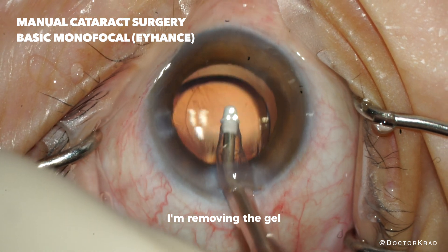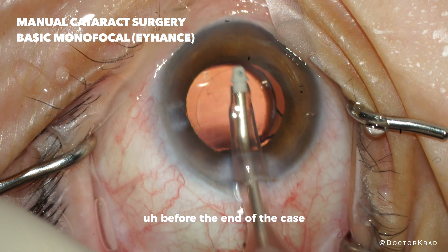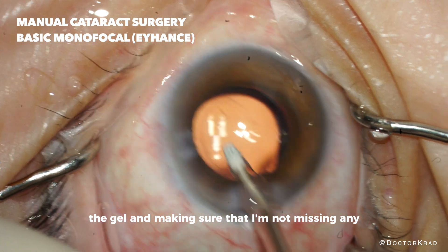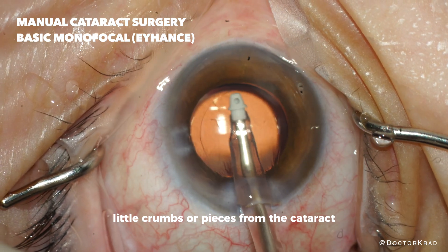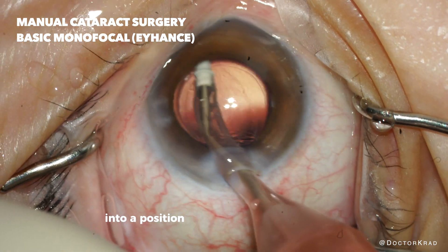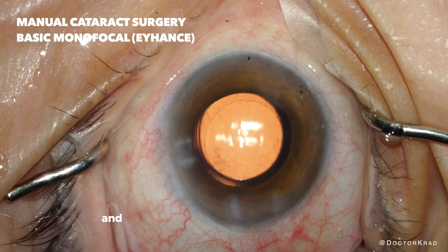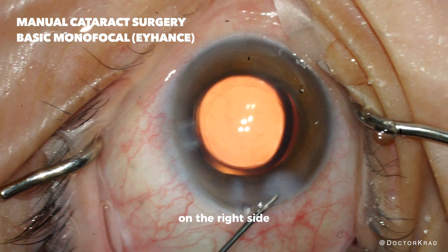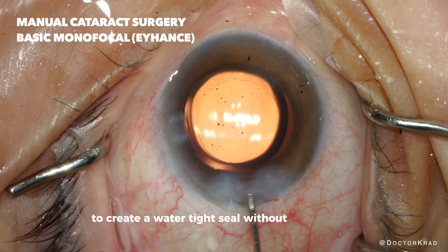I'm removing the gel. The gel has to be removed before the end of the case. So I'm removing the gel and making sure that I'm not missing any little crumbs or pieces from the cataract. After the gel is removed I'll rotate the lens into a position where I think it centers best. Then we're going to hydrate the incision — on the right side, on the left, and also the roof — to create a watertight seal without any stitches.